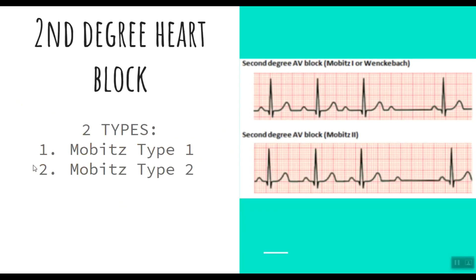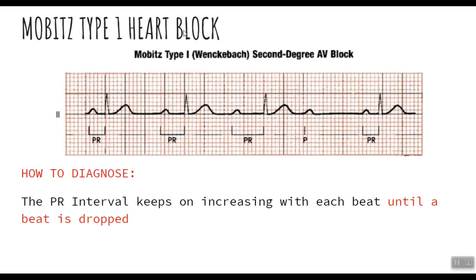Moving on, we have second degree heart block, which has two types: Mobitz type 1 and Mobitz type 2. In Mobitz type 1, the PR interval keeps increasing with progressive beats. You can see the PR interval is short here, then increases a little with the next beat, then increases to maximum, and finally a QRS complex is dropped. Then the cycle repeats: short interval, then longer, then longer, then a beat is dropped. This is diagnostic for Mobitz type 1 heart block.